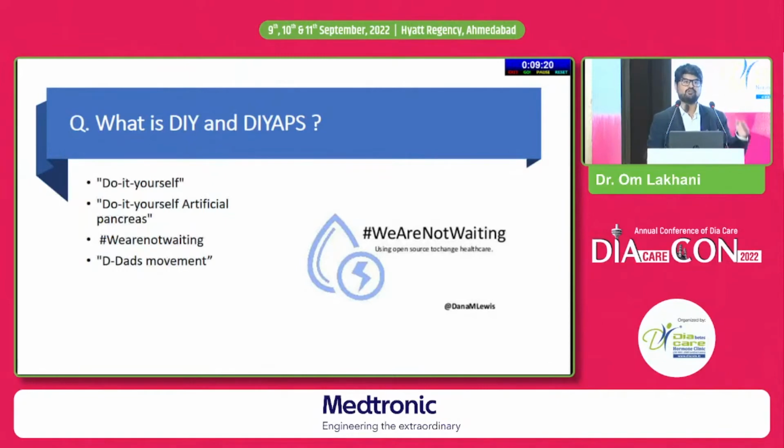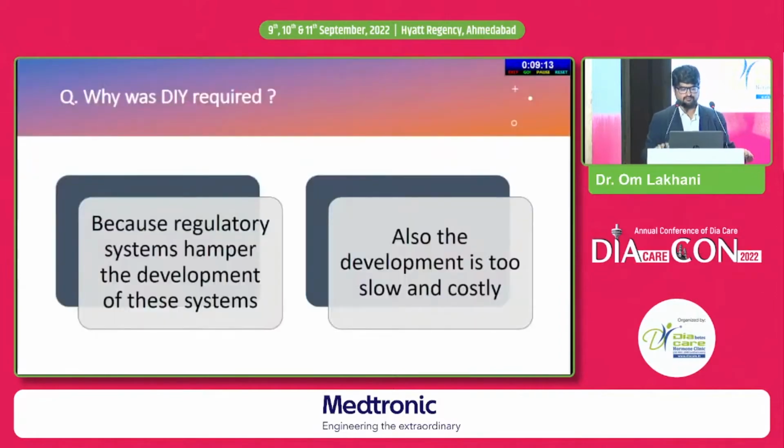There's a lot of contribution done by DDads. DDads are dads of diabetic patients, and they have contributed a lot to the world, right? So what is DIY? DIY is do it yourself. What these people said was that if these companies are not going to make an artificial pancreas or sophisticated pumps, we'll do it ourselves. Like I said, regulatory issues slow down the process of development, and the development is very costly.